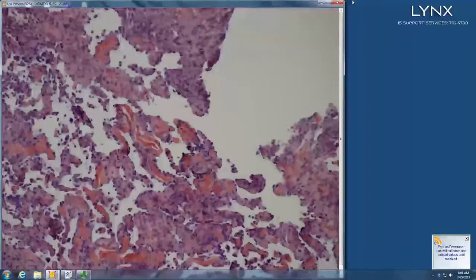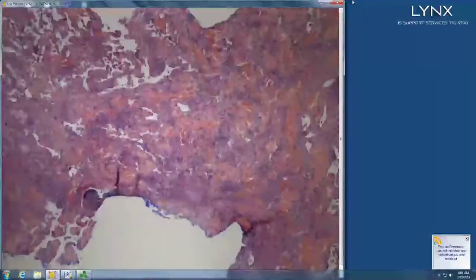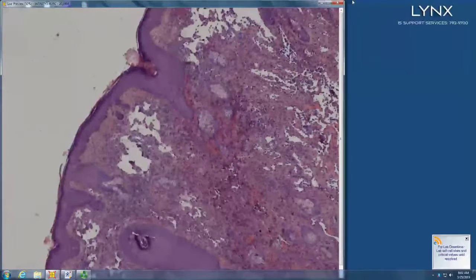Absolutely, could be KS, or conventional angiosarcoma, which this was. So a very ectatic conventional angiosarcoma or a lymphangiomatoid KS. If it wasn't an old man on the forehead, I probably would check an HHV8 in it.